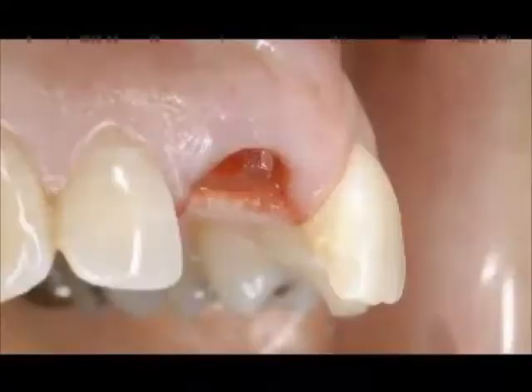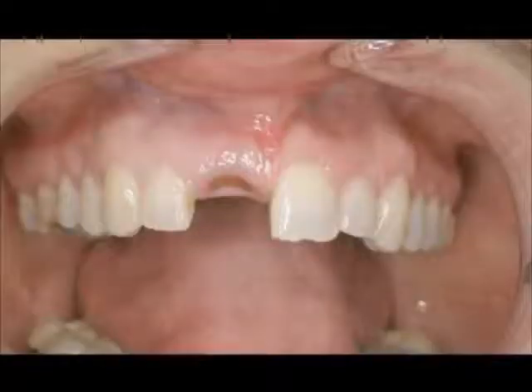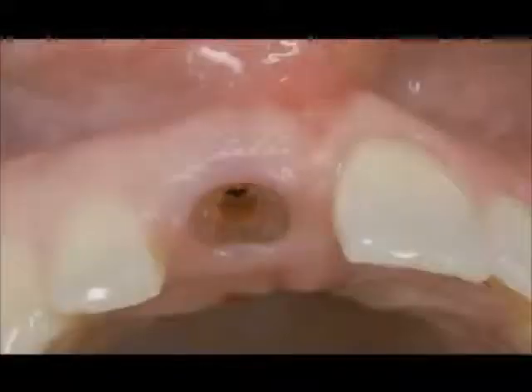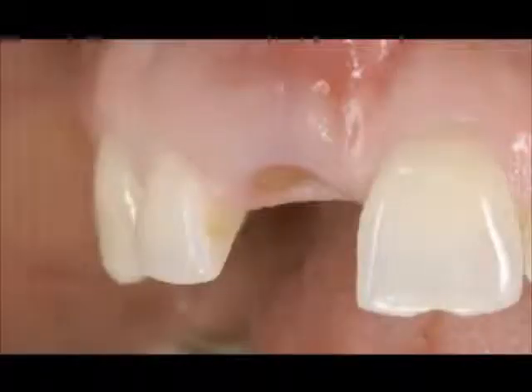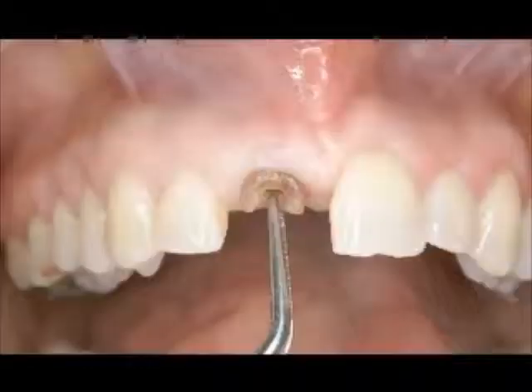You can shape this if you want with a burr, and you can see how it supports the papilla interproximally during the healing phase much better than this more historical method of just a traditional healing cap. This is what it looks like at approximately 6 days. You can see how that healing cap has supported the interproximal walls and the papilla height, and yet was rounded on the buccal and diminished contour on the facial, so it did not cause recession of the facial tissues.